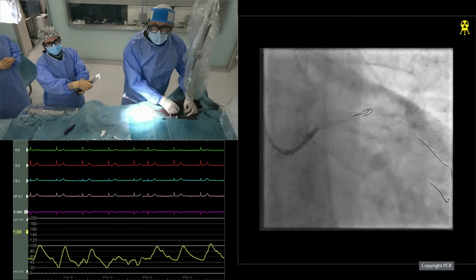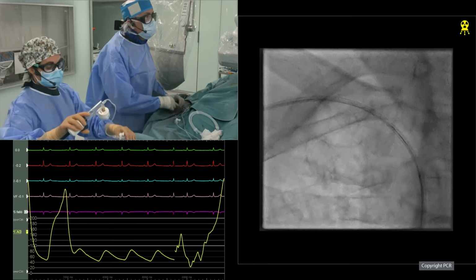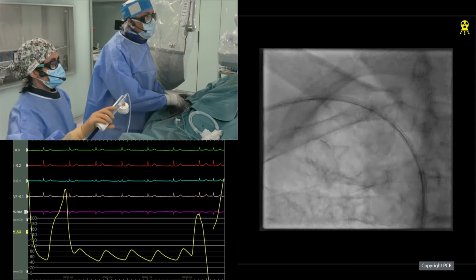Of course it depends. But in a case where you have done some runs in the middle to check calcium modification, I think it has to be a balance. You need to decide when is the most important moment to use it, because I don't think, in general, you can do lots of runs. Definitely, if we have any doubt about the position of the wire, we would do it, of course.